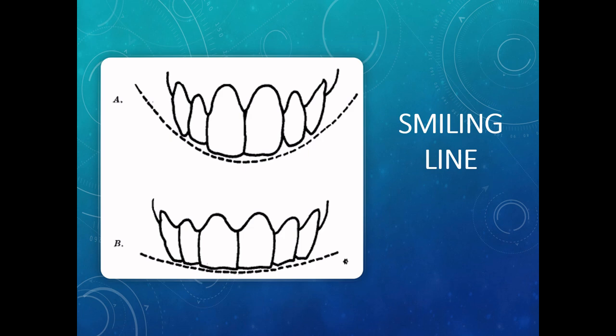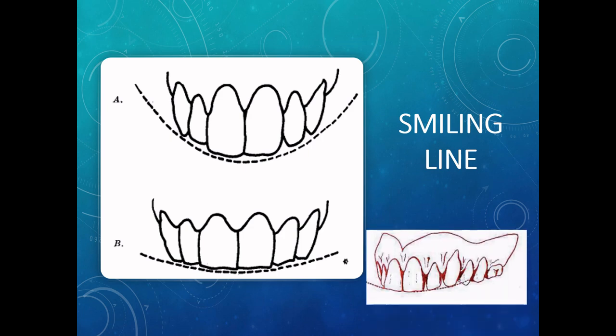And the arc of the smile line is determined by the age of the patient and it decreases as the patient gets older. So in figure A, the sharp curve of the smiling line gives a youthful appearance, whereas in figure B, the broader curve indicates an older dental composition. And also the curvature of the incisal line is more pronounced for women than for men. A curve suggests softness. So grinding of the incisal line to create the curve expresses femininity.